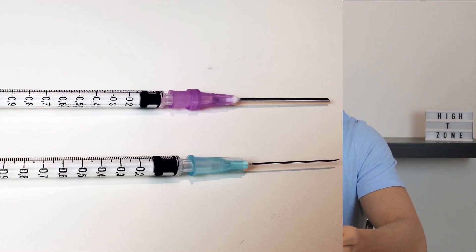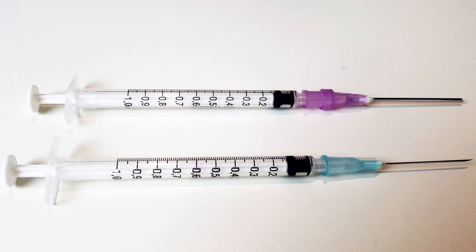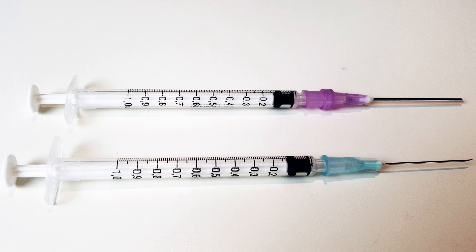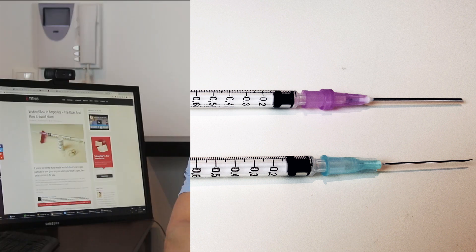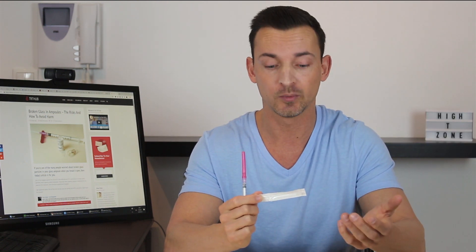You should be able to see the difference between a normal needle and a filter needle, and see the little device in the filter needle that does the filtering. Another way you can identify it is by simply looking at the packages — they're sold as filter needles, and at the back it says 'blunt fill needle' like normal but with a micron filter.